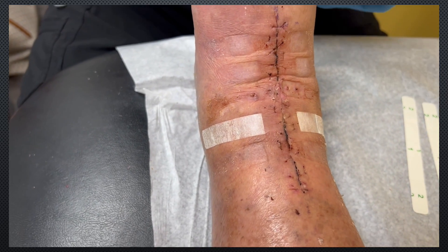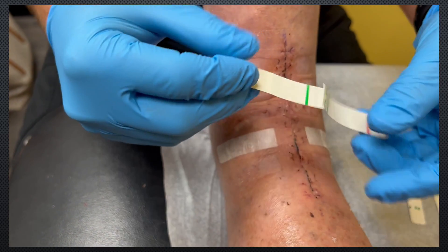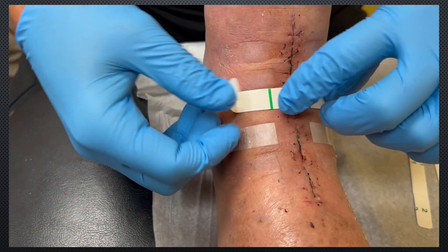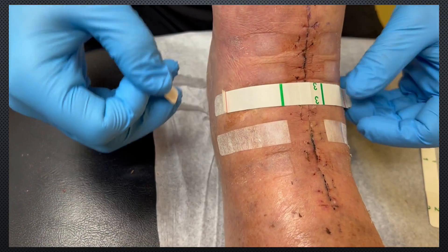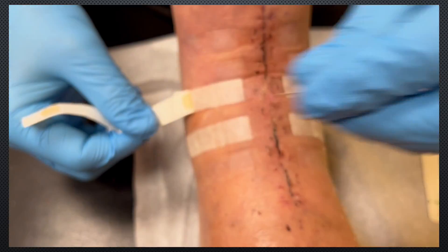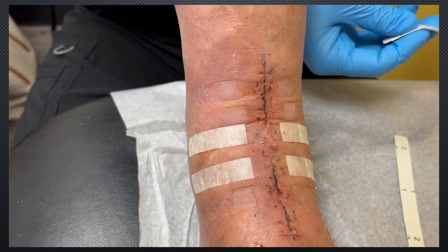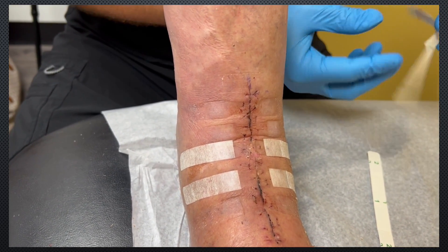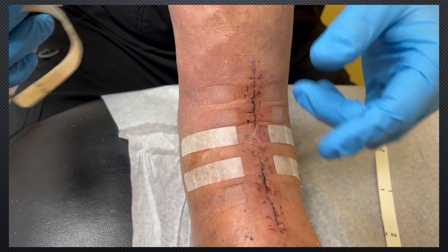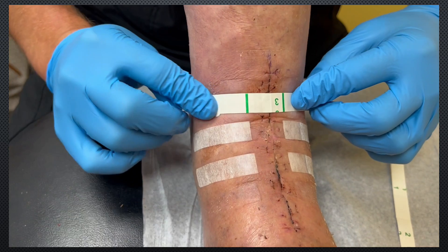Again, we're going to take number 1 off, stretch it all the way out, put it down. Roll number 2 on both sides. Roll number 3 off. They come in a pack of 4, so typically we'll use all 4. But really focus in on the central portion of that incision, which is where dehiscences are most likely to happen.